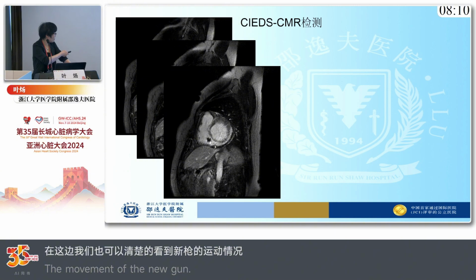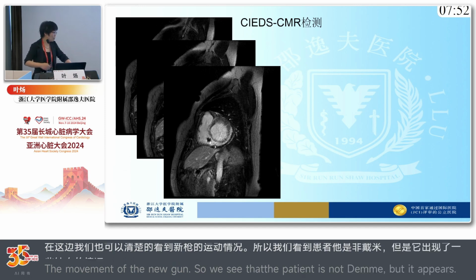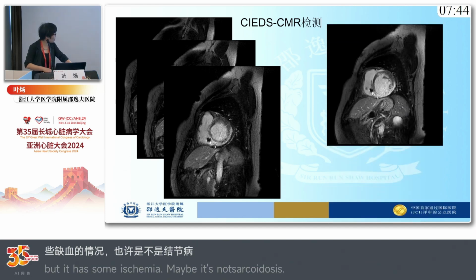That it is just comparable to the echo result in left ventricular inferior wall scar. The patient has non-ischemic cardiomyopathy, but she has ischemic scar. Very interesting, right? So we were wondering, probably it's sarcoidosis. This is very strange, but I have this idea. And we show our scanning here.